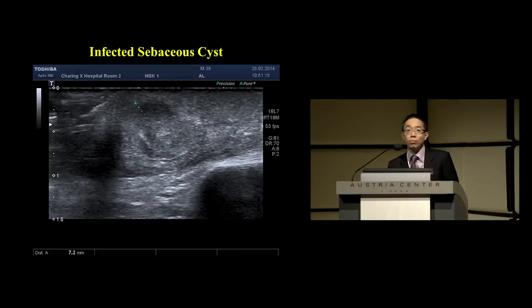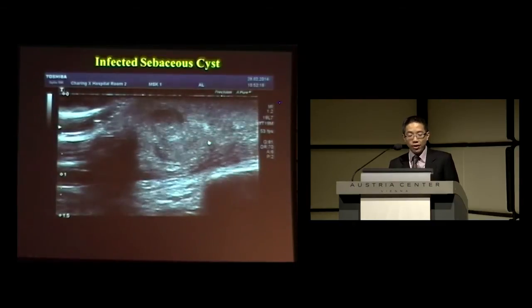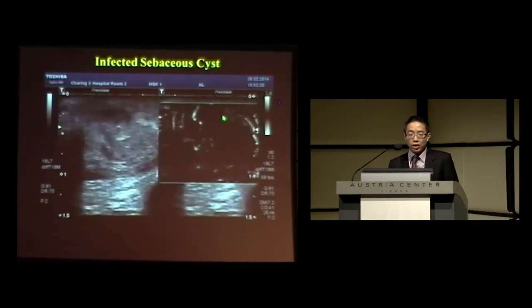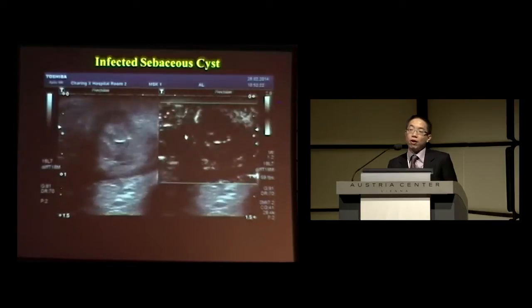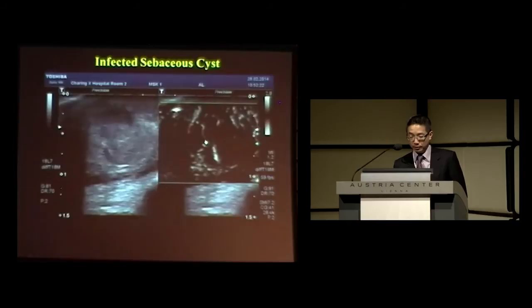Here is another example where SMI can be extremely useful: a patient with a collection within the skin, with some pointing to the dermal layer, looking like a sebaceous cyst. Is this infected? When you turn on SMI, you can see the soft tissues around it are markedly vascular, confirming that this sebaceous cyst is infected.